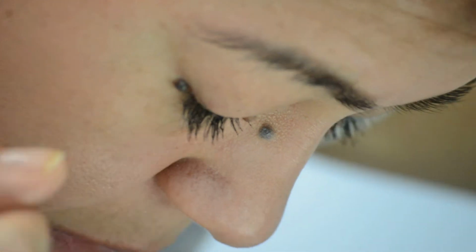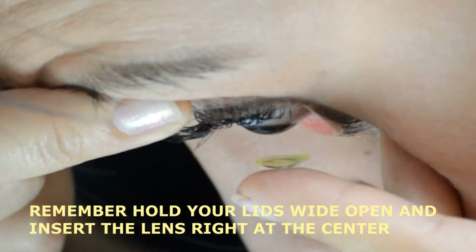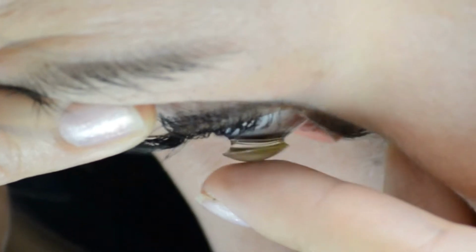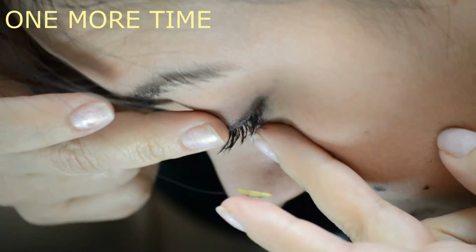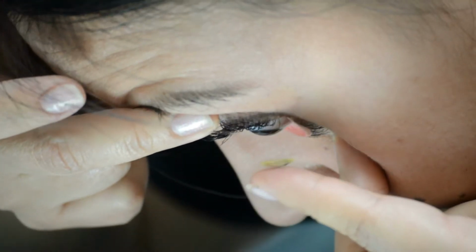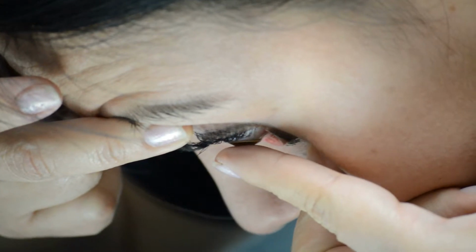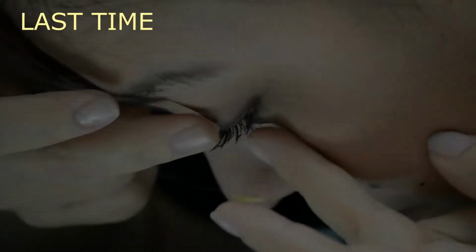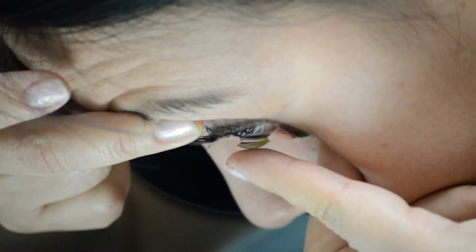Got it? Now let's do the same thing on the other eye. Remember to hold your lids wide open and insert the lens right at the center of your eye. Let's do it one more time. Hold your lids wide open and place at the center. One last time. Open and place.